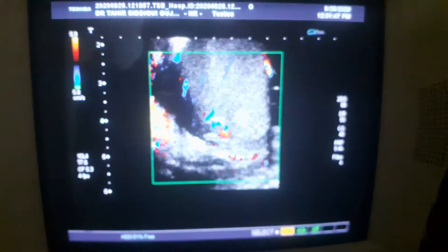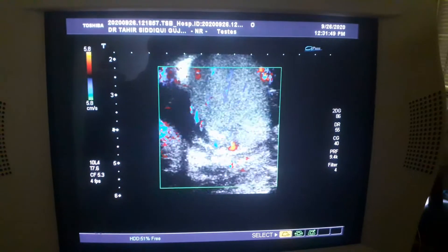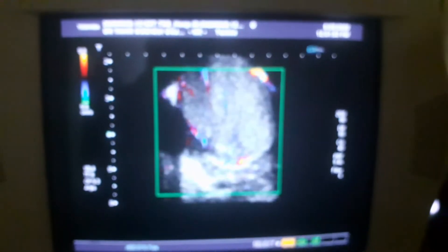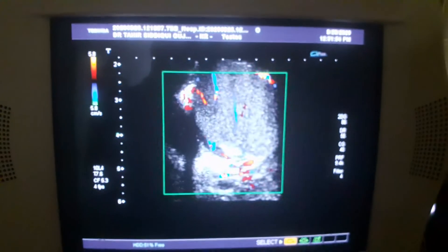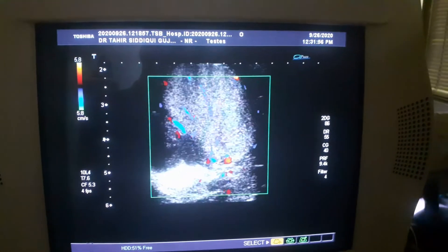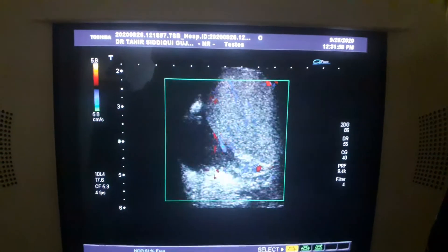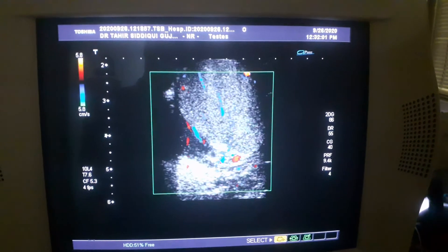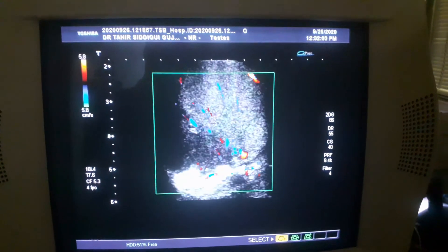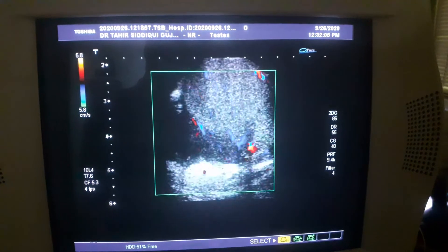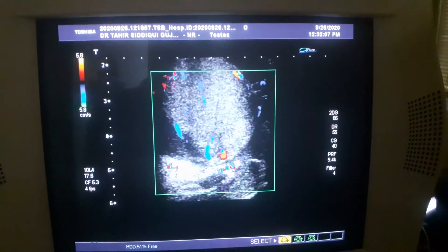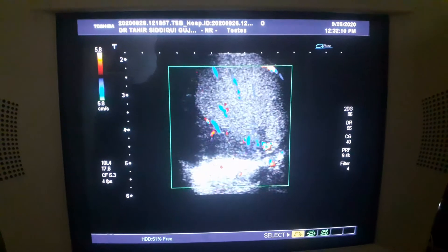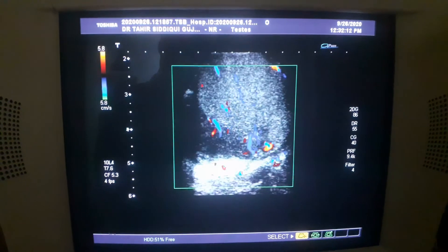Now, this is the testis. The testis by itself is normal. The testis is normal. However, there is fluid with echoes, with septals, with debris surrounding it.